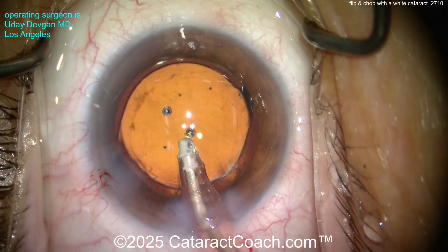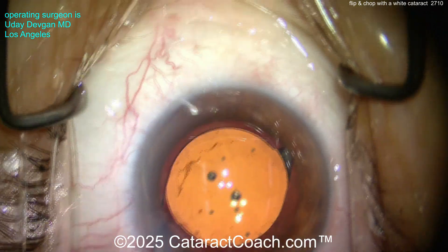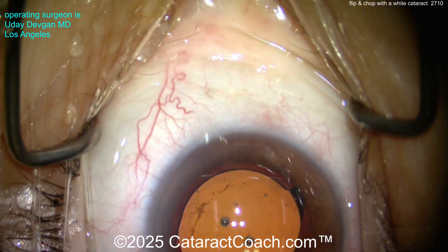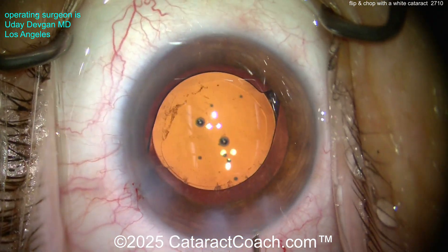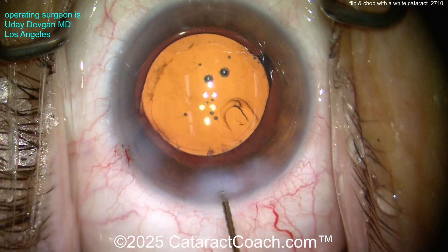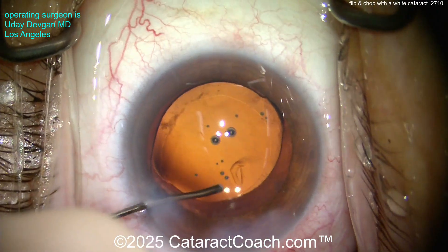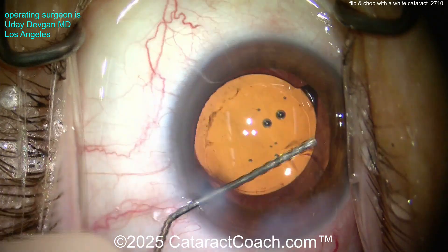You can see the rhexis is about six millimeters — probably a little bigger than five, maybe 5.2 or 5.3. Let's hydrate the incisions and seal this up. You may notice a little bit of smudgy stuff on the posterior capsule; sometimes you can't get all of that off in these white cataracts, and that's okay — no big deal. This patient is going to be amazed on post-op day one with a clear cornea.